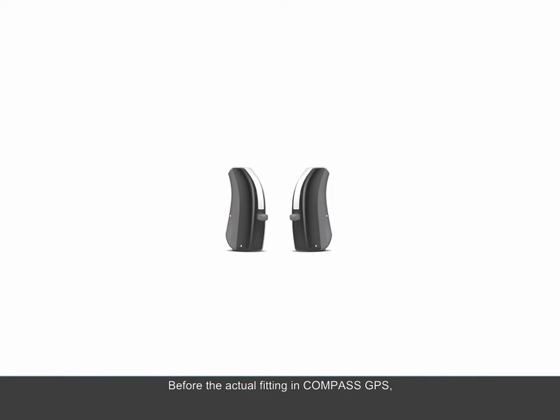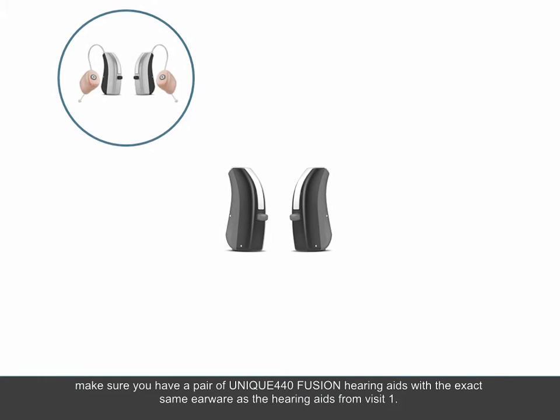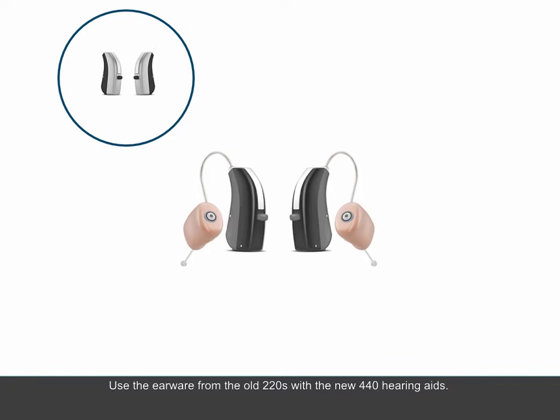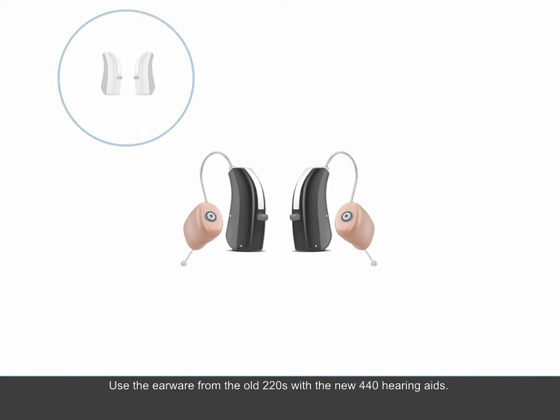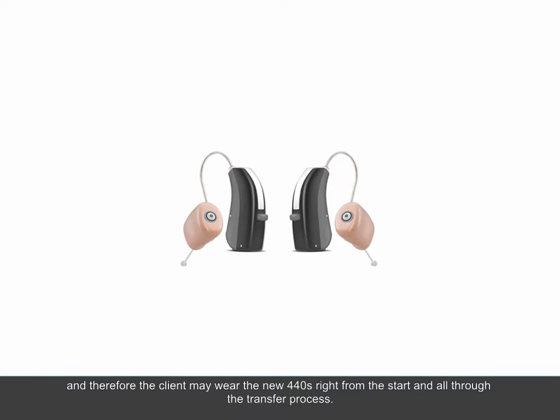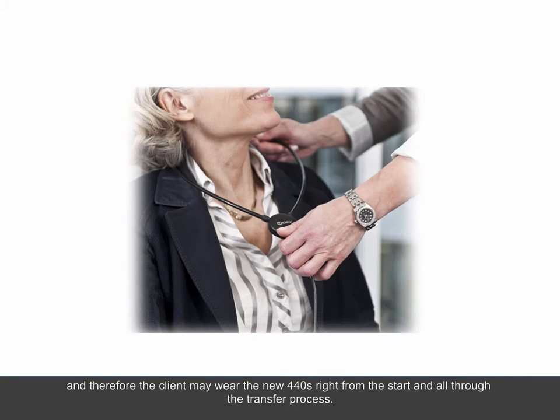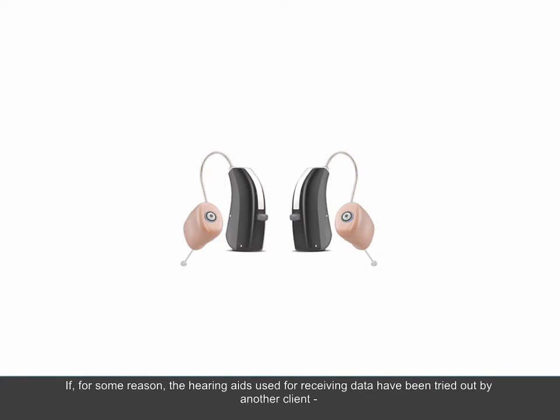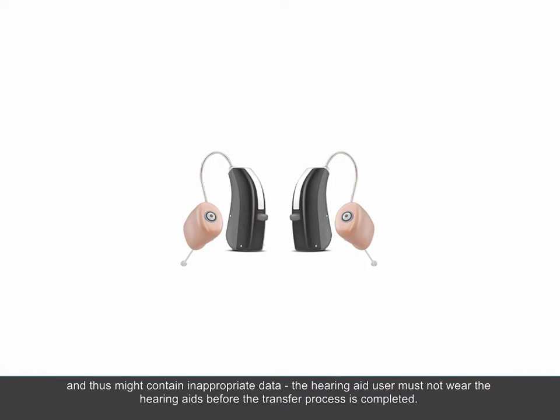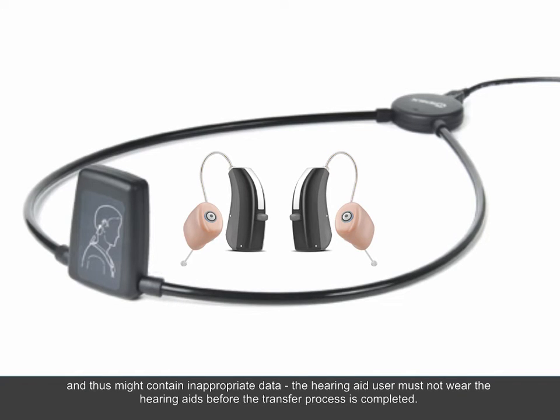Before the actual fitting in Compass GPS, make sure you have a pair of Unique 440 Fusion hearing aids with the exact same earwear as the hearing aids from Visit 1. Use the earwear from the old 220s with the new 440 hearing aids. Please note: we describe a scenario where the 440s have never been fitted before, and therefore the client may wear the new 440s right from the start and all through the transfer process. If, for some reason, the hearing aids used for receiving data have been tried out by another client and thus might contain inappropriate data, the hearing aid user must not wear the hearing aids before the transfer process is completed.